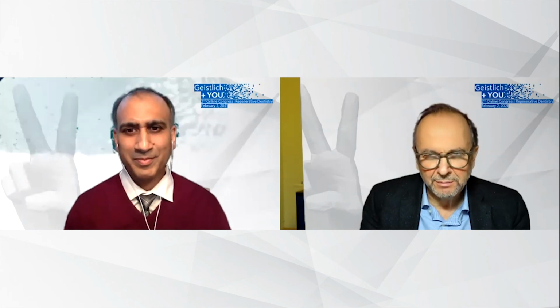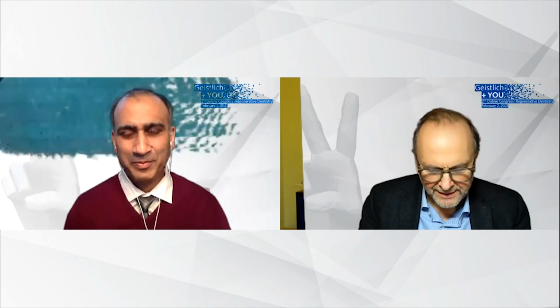As a non-periodontist, I will try to ask you some important questions. One is, when I have seen this volume of the Fibro-Gide, and we have seen that in our study as well, sometimes it's damn difficult to really cover the site with the flap. Now, do you always do an incision of the periosteum to mobilize the flap?